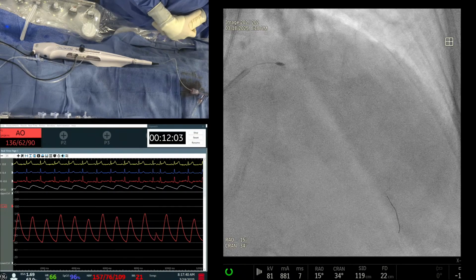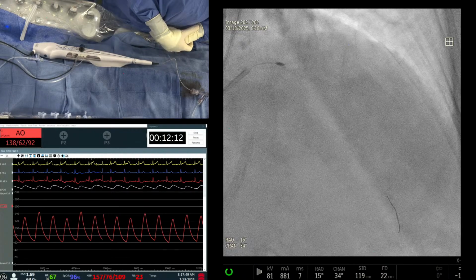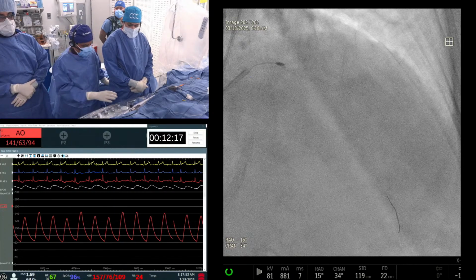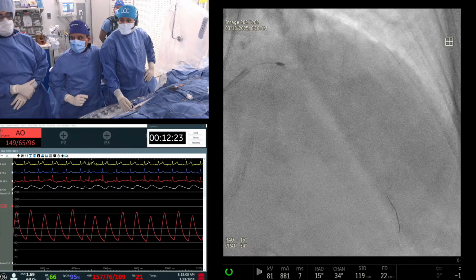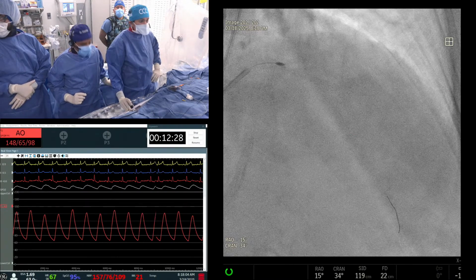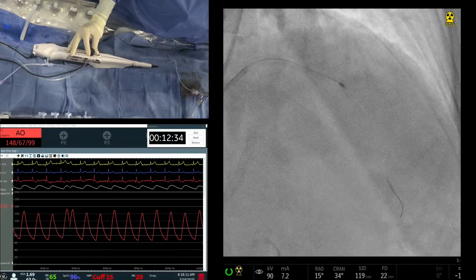And that is where David Auth came in: for any burr less than 2, your ideal speed is 160 to 180. And of course, once you go to the bigger burr, then you go to 150, 160. But we are starting with the 145. So we are just going to increase. Definitely, absolutely not worth the cost of a 1.25. Yeah, that's right. 160.